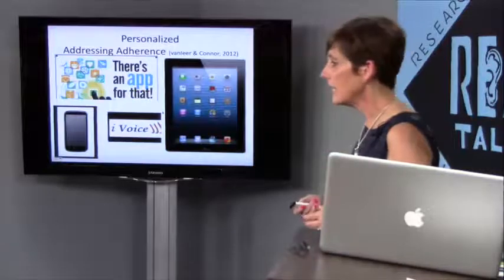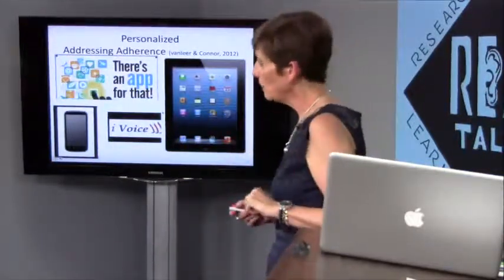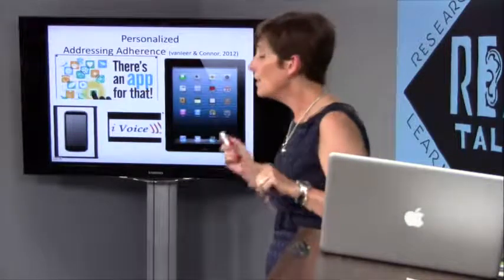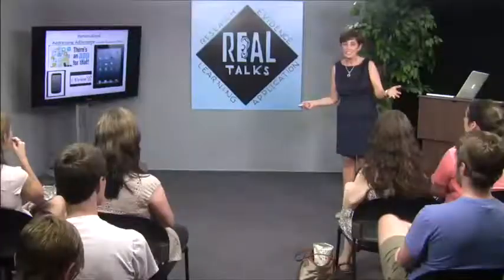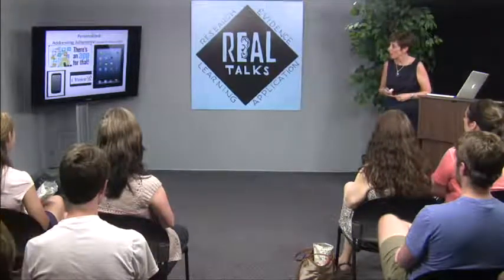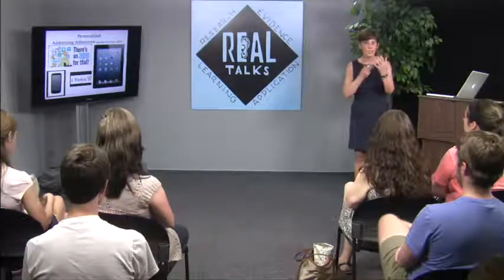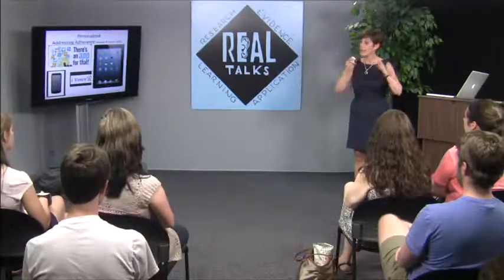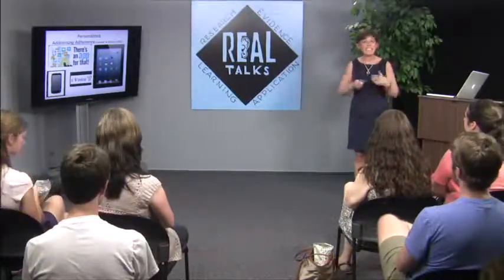Because Ava Van Leer and Nadine Connor taught us as recently as 2012, when patients use gadgets, they enjoy therapy more. And when they enjoy therapy more, they're more likely to practice. And remember, the only way voice therapy works is if you actually do it. One of the new devices that's coming out that I've been playing around with for some colleagues is called the iVoice. And that is a personalized smartphone-based product that allows people to practice in any scenario, to keep track of voice things, and to even easily send messages to their clinicians. Crazy.